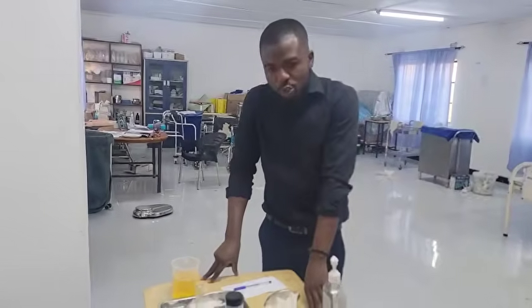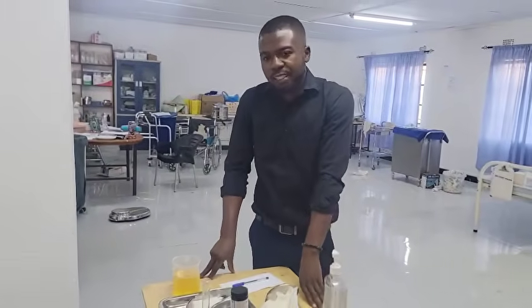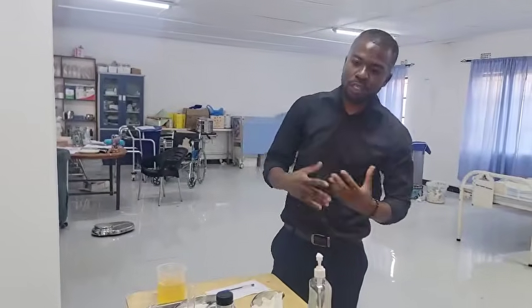Munyanyembe. So, we want to look at urinalysis. So now, what is urinalysis? Urinalysis is a procedure where you collect urine from the patient in the ward, and then you check the urine contents. Yes, so you look at the physical properties as well as the chemical properties of urine.